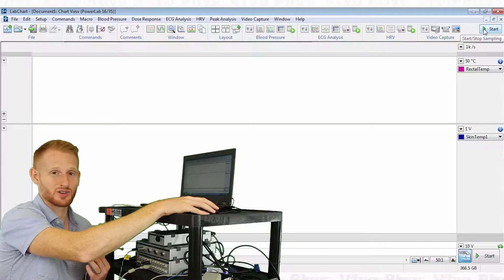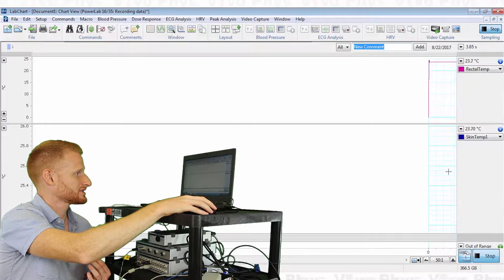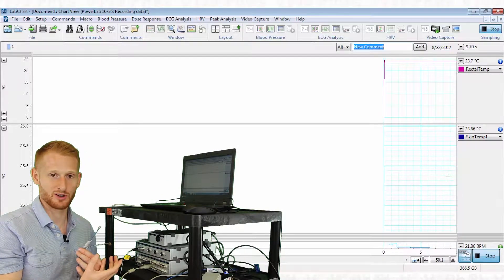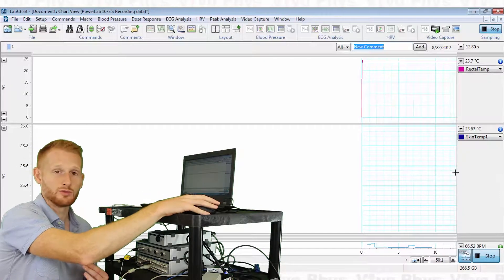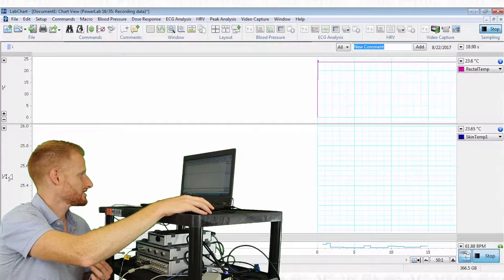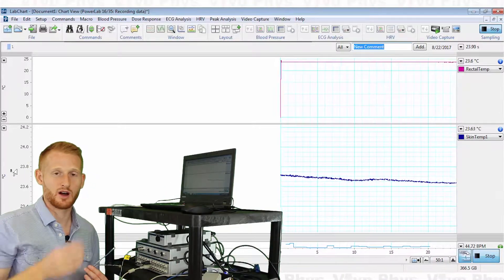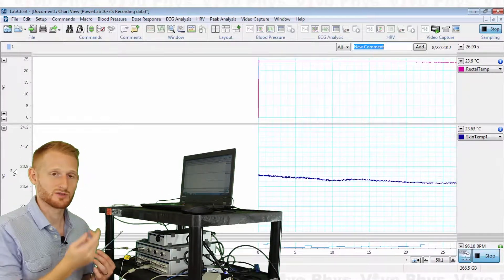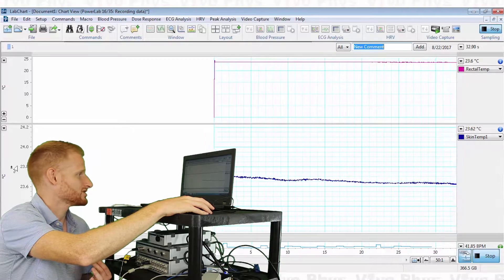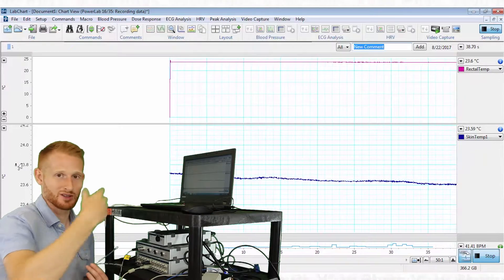I'll hit Start now so you can see it begins recording data. Some channels aren't always scaled so the current value falls in the viewable part of the screen. For the skin temperature, if you don't see a line, just come over to the empty gray space and double-click — it does a quick auto-scaling of the Y-axis so you can see the trace. If it doesn't look right, keep double-clicking for different scaling options until you get back to a good view.